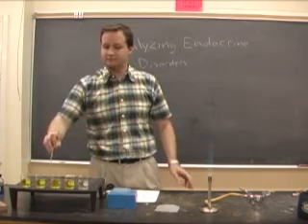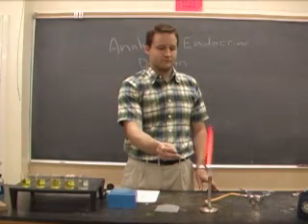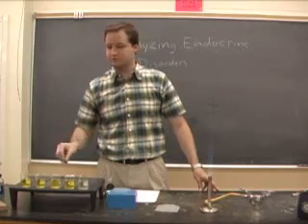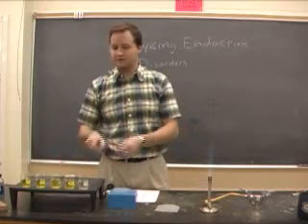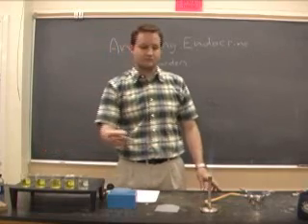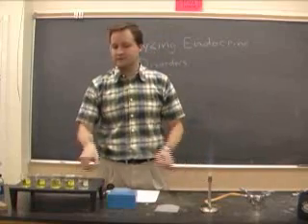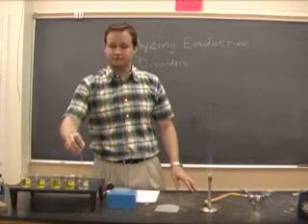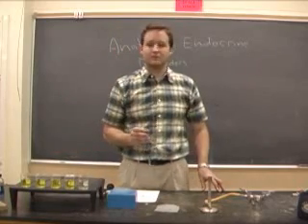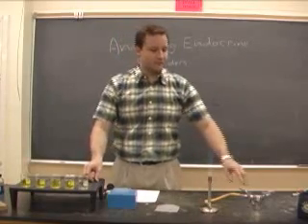Sample C. Okay, that was clearly not blue. Sample D. Blue. And lastly, sample E. Blue. Excellent. So that was testing for the presence of sodium.